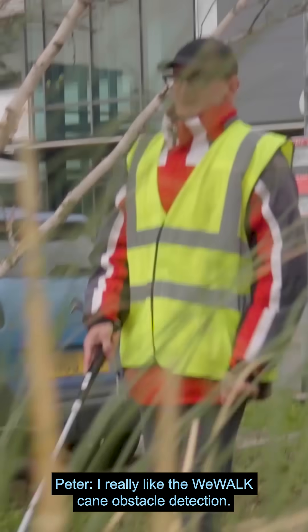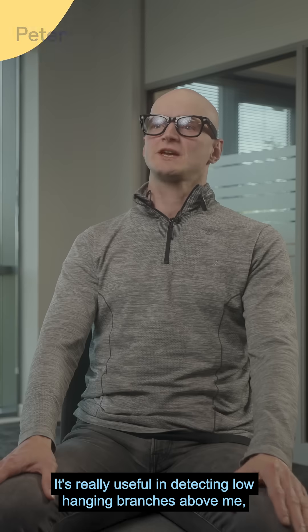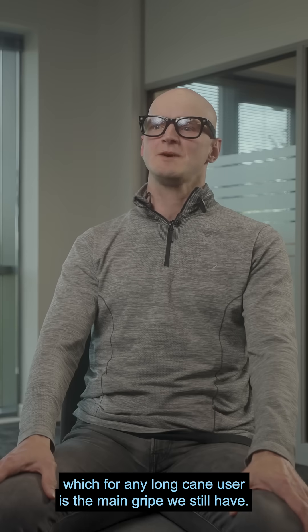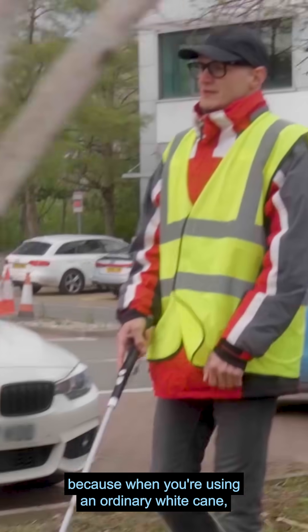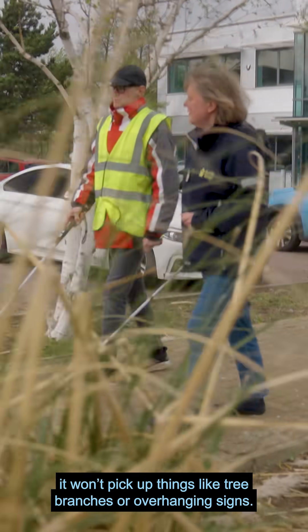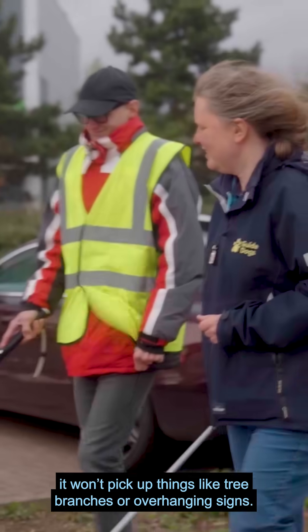I really like the WeWalk cane obstacle detection — it's really useful in detecting low-hanging branches above me, which for any long cane user is the main gripe we still have. It's why we all wear peaked caps, and that's the ideal use case for this, because when you're using an ordinary white cane, no matter how careful you are, it won't pick up things like tree branches or overhanging signs.